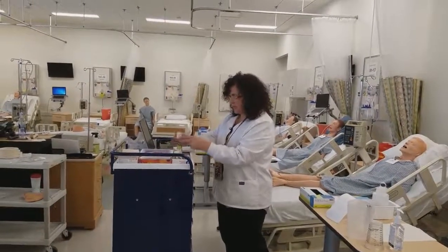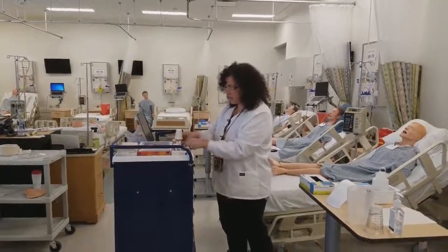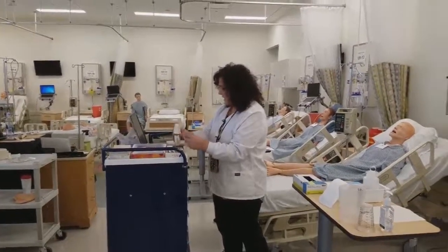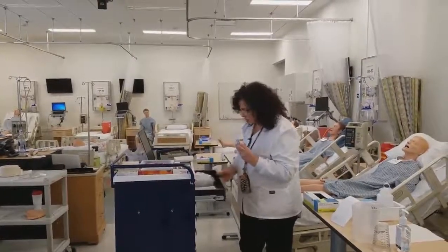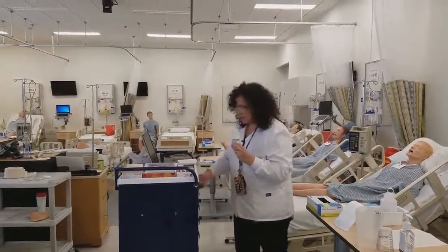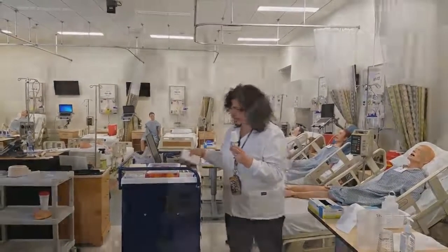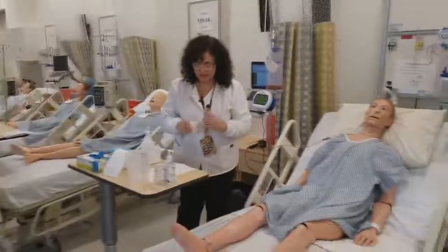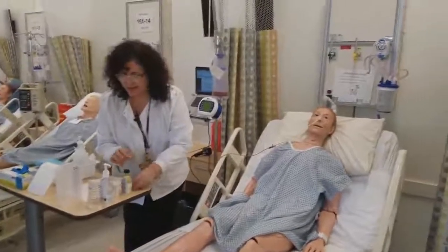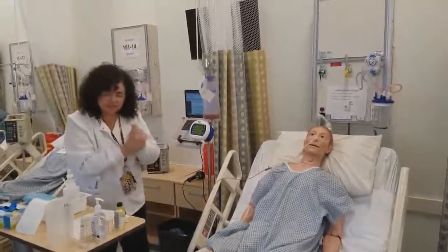So I'm just going to grab some cups here. I have a couple different varieties, so you can choose the one that you like best. And then I am going to be sure that I have something to stir in order to mix these, and that should do it. So I'm going to enter the patient's room, and I'll put my medicines down for right now because I have to check my tube and my tube feeding first.